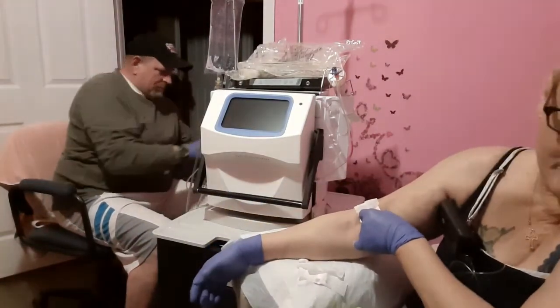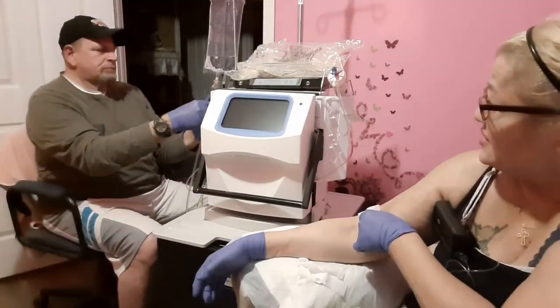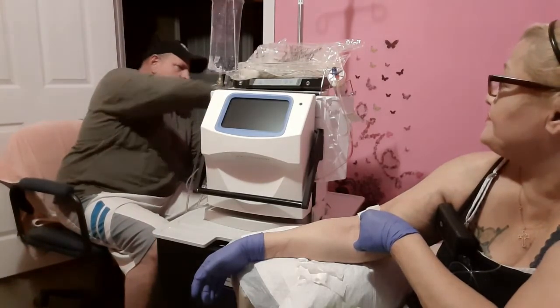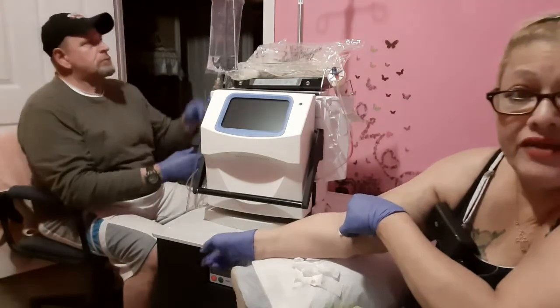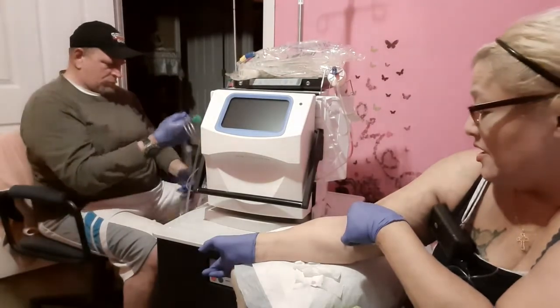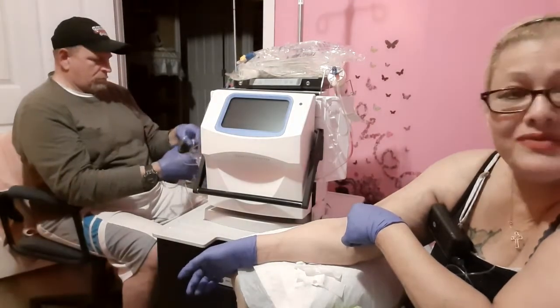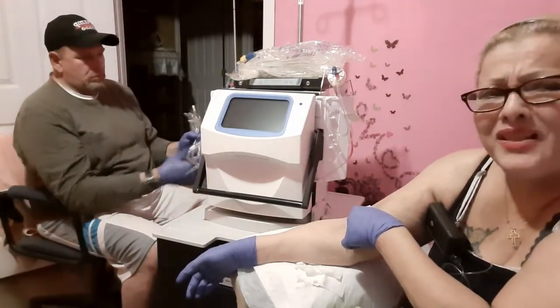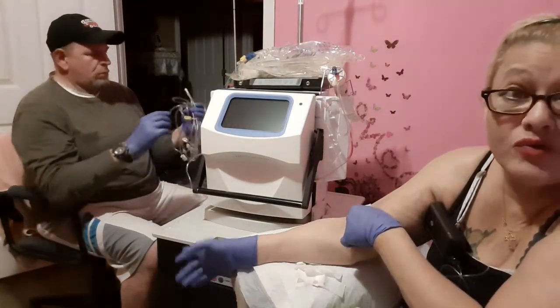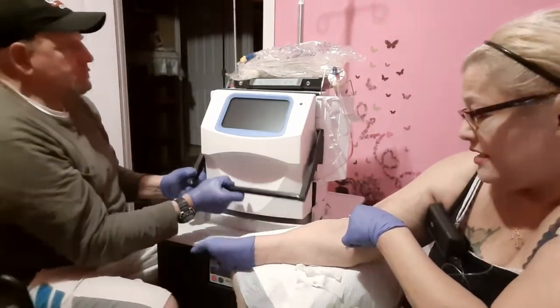Hubby can go ahead and break down the machine, the cycler. And we removed the bag from down here. We drained it out and Hubby removed it and disposed of it. And we'll put a new one in tonight. Hopefully it'll work. It just kept saying that there was fluid in the bin, but there wasn't any. So like I said earlier, it must have been a leak in the bag once it filled up. So we went ahead and drained the bag, and we removed it.